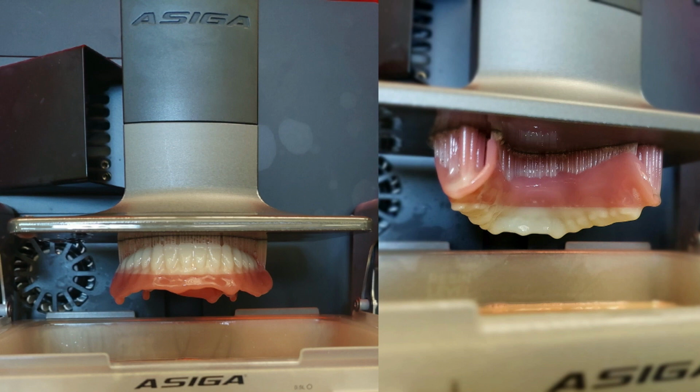But you can do other cool things. I want this range from here to here to be printed in pink. I'm going to switch out my resins, and I'm going to print this range from here to here in white. So, is it the best result? No. Am I going to deliver this? Probably not. But again, it's just a proof point, just to have a little bit of fun, right? It's not the best looking result, but it's kind of cool what you're able to do with this.